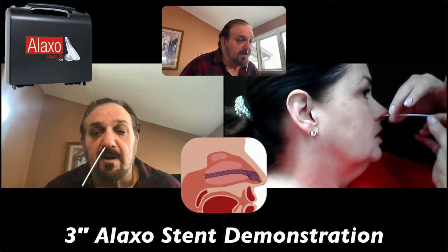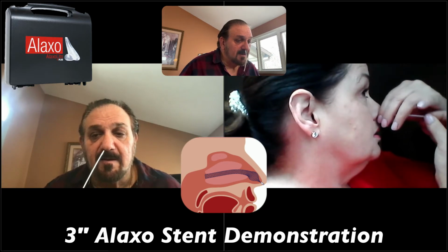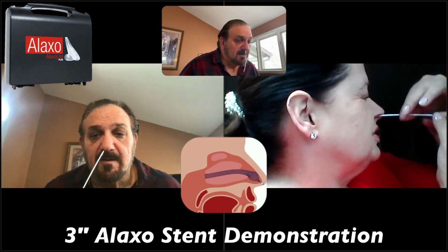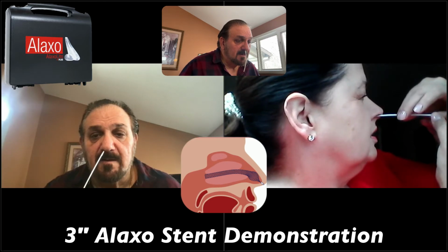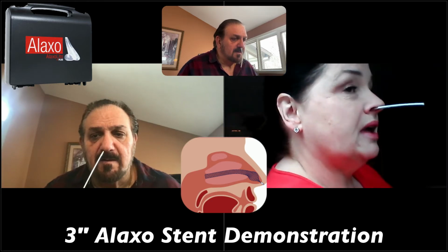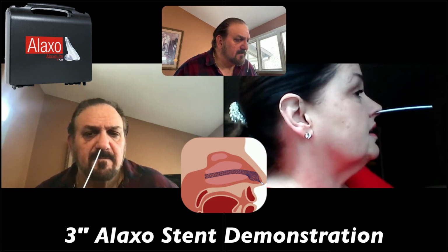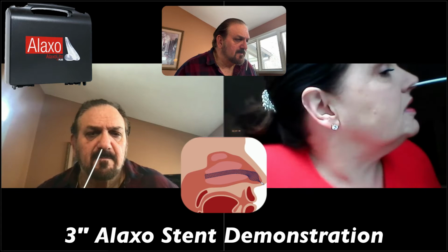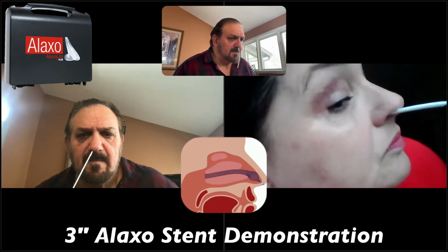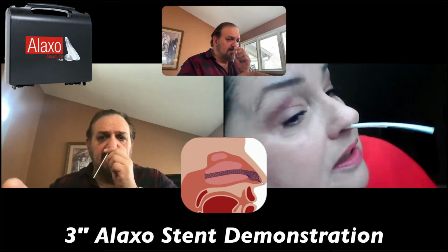So show me the introductory way, not the way you seasoned do it. So here's the black, here's the tube, you just pull it off. You can even just pull it off a little bit there. It's starting to expand. The tulip part of it now is half expanded against my turbinates inside. Can you see here? I've just got it about halfway. Yes, I guess. It's hard to see because of the color of the tubing, but it's just about right there.